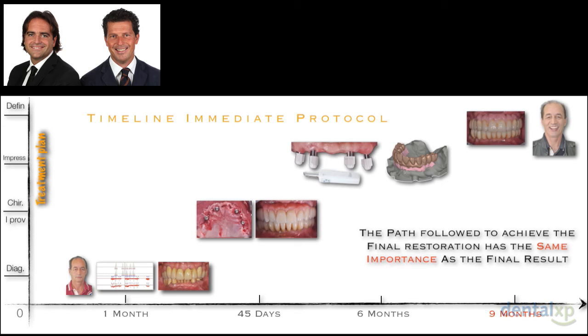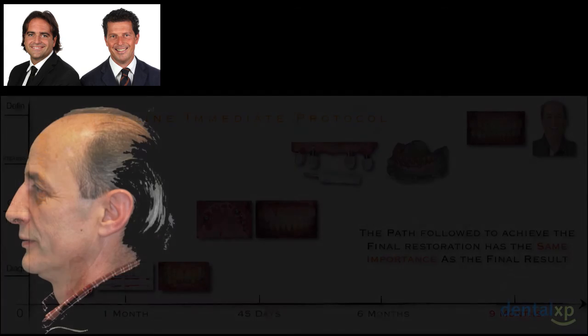And we see that the path followed to achieve this final restoration is, from the clinician point of view, as important as the final result, that of course is the most important thing for Sergio. And you can see here how important it is always to take a picture of the smile.